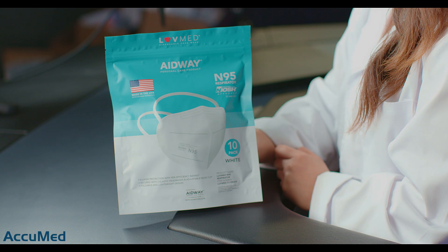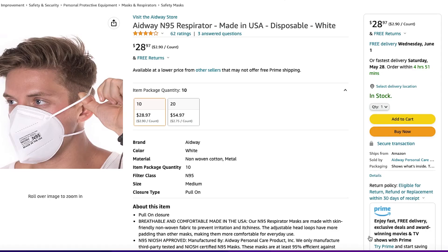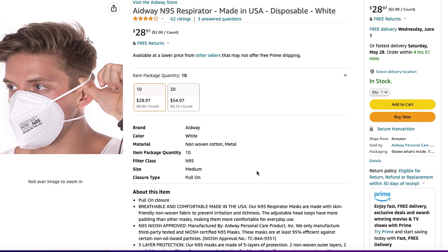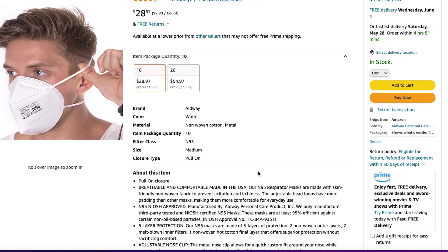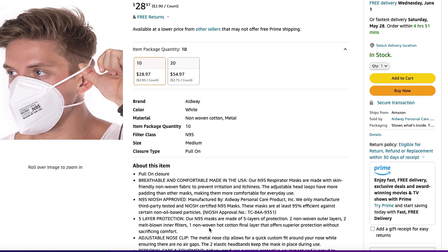Hello everyone and welcome back to the AccuMed channel. Today we're going to be reviewing the Aidway N95 respirator. These are made in the U.S. The Amazon listing states that these are a five layer respirator. We ordered a 10-pack which cost $28.97, making them $2.90 each. They have a 4.1 out of 5 rating with 62 reviews and they're being sold by Aidway.